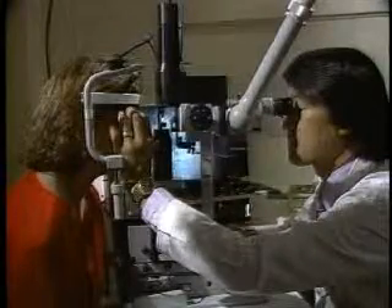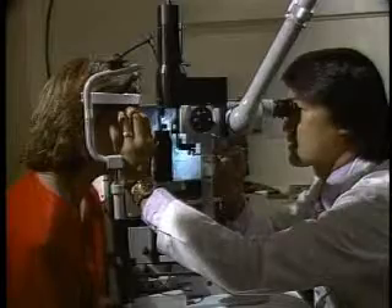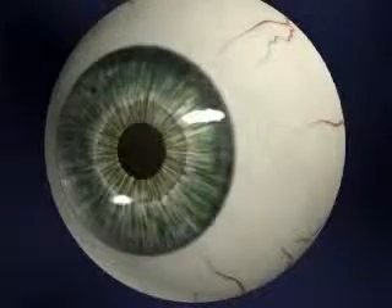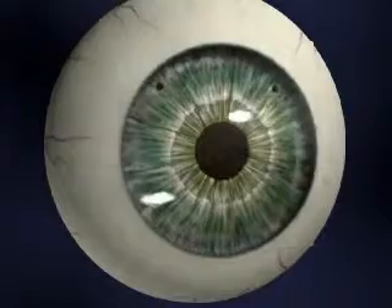One to two weeks before insertion of the ICL, your surgeon will use a laser to make one or two small openings near the edge of your iris, which is the colored part of your eye. These openings serve as outlets which will allow the fluid in your eye to circulate around the lens.